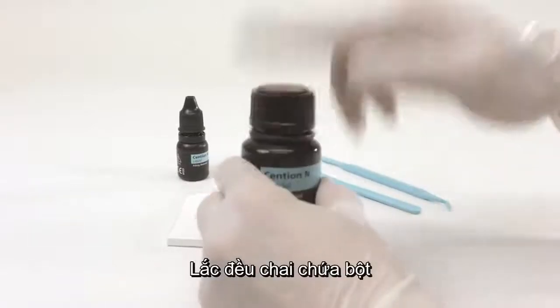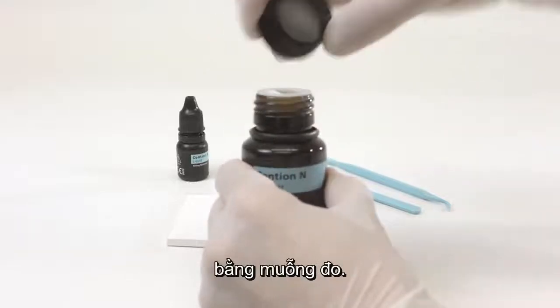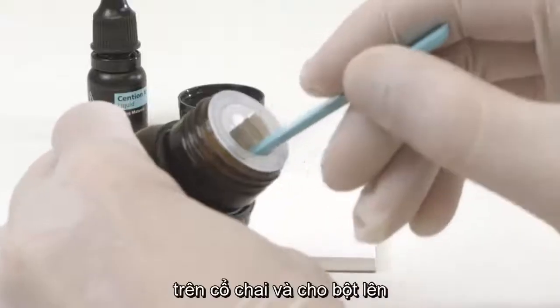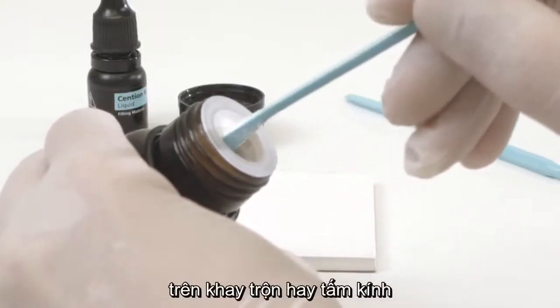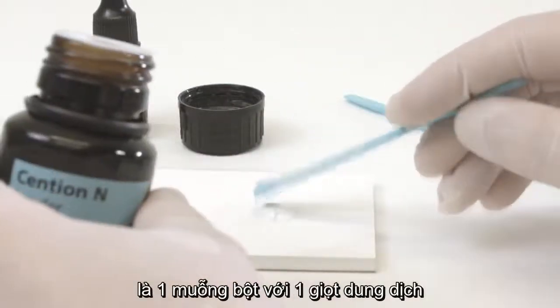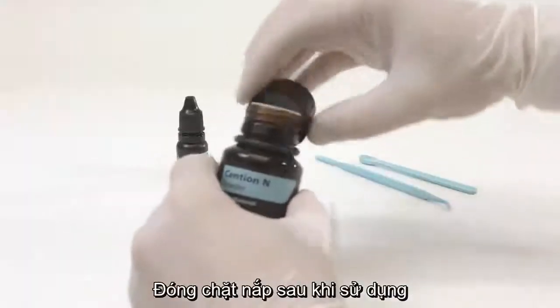Shake the bottle containing the powder before use and then remove the required quantity using the measuring spoon. Wipe off excess powder at the plastic insert of the bottleneck and place the material on a mixing pad or glass plate. The mixing ratio of the powder and liquid is one measuring spoon of powder to one drop of liquid. Close the bottle tightly after use.